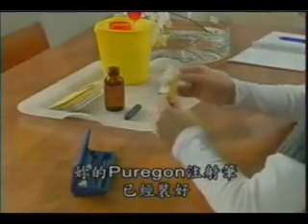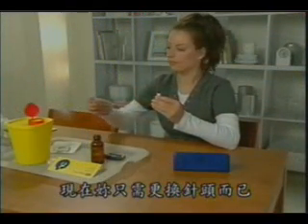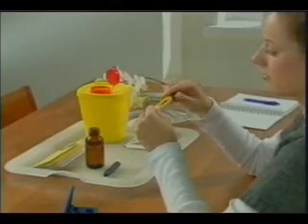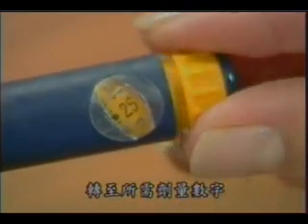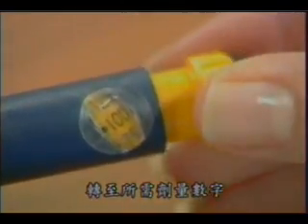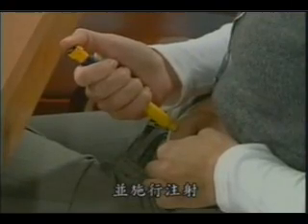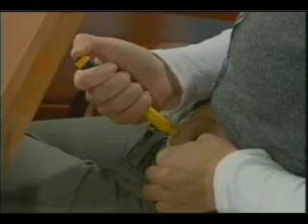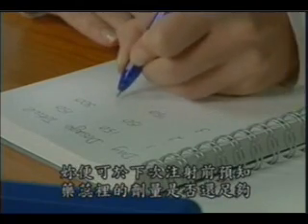Your Puregon pen is already loaded, and all you need to do is attach a new needle. Dial the recorded position on the dosage scale. Inject the prescribed dose. By keeping records of the injections, you can see whether there is enough drug left in the cartridge for your next injection.